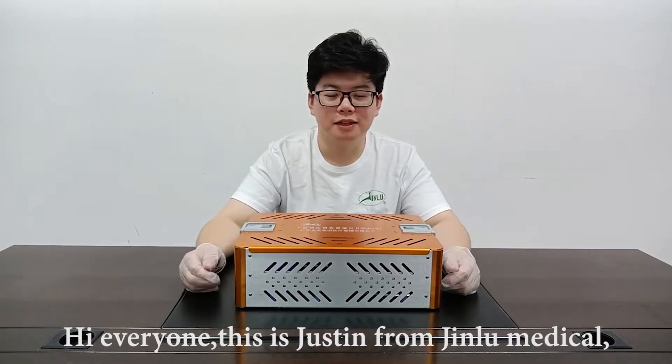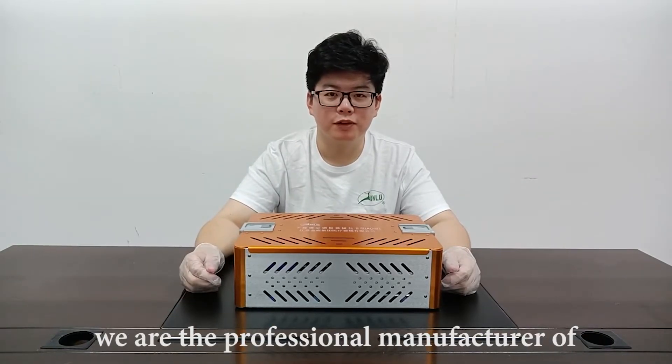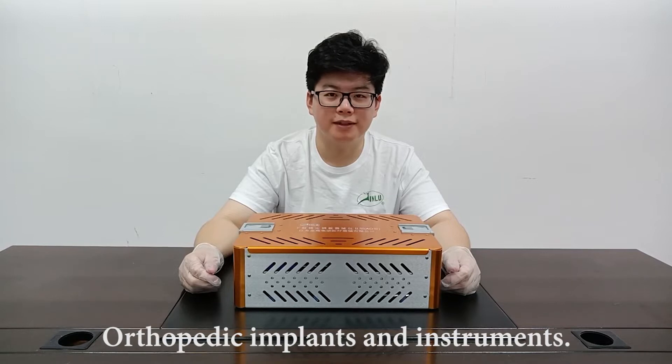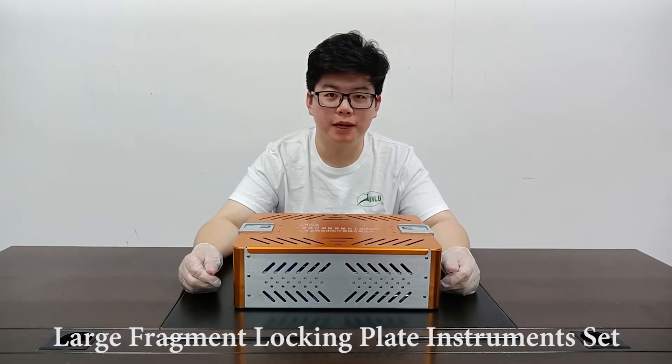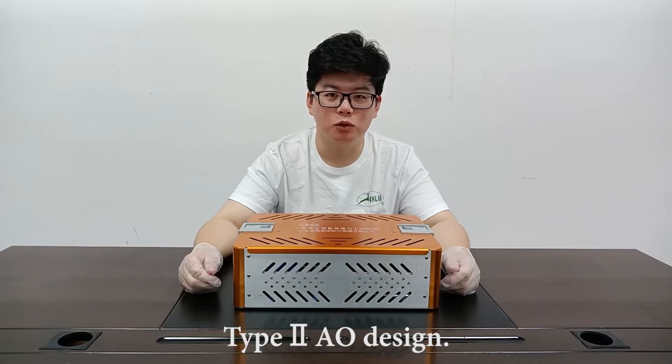Hi everyone, this is Justin from Jinlu Medical. We are the professional manufacturer of orthopedic implants and instruments. Today I am going to introduce our large fragment locking plate instrument set, Type 2 AO Design.